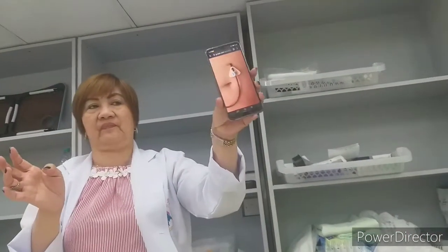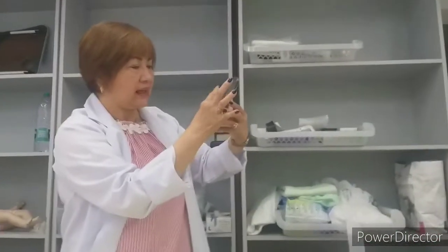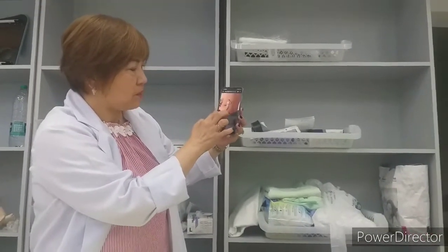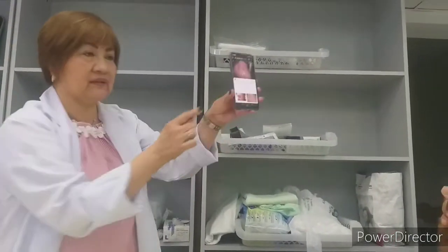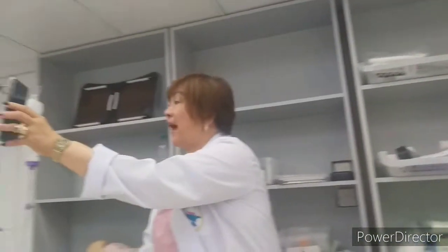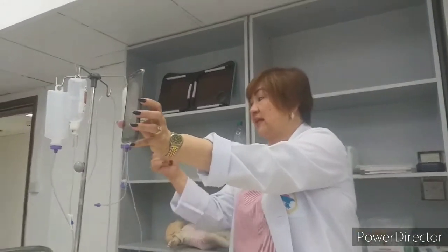Tapos pag hindi ginagamit, naka-close lang siya. Ayan o. Meron siya dapat clip. Naka-clip yun eh. Hindi ko makita yung clip. There is a clip somewhere here. Parang clip lang siya. Ayan. So, if you are not going to use your peg, there is a clip. Means to say it's closed. Sarado na siya. Okay? So, there is a clip.